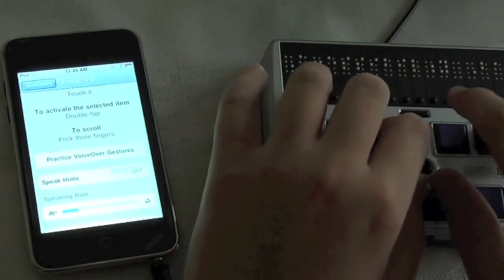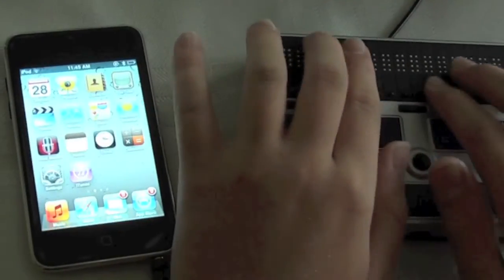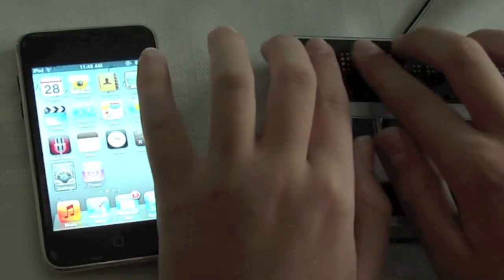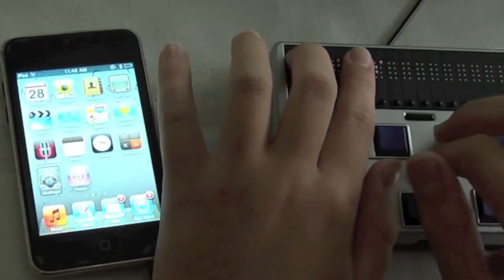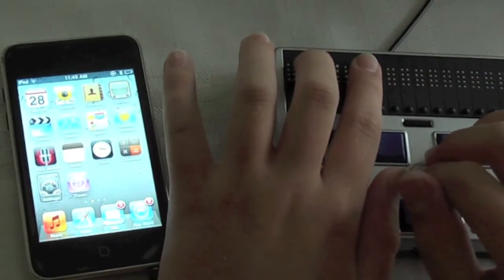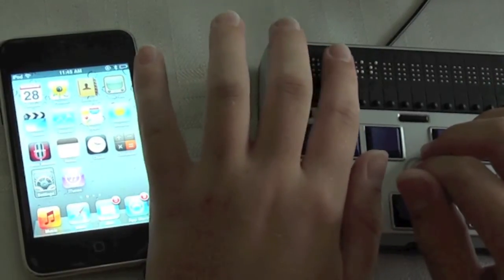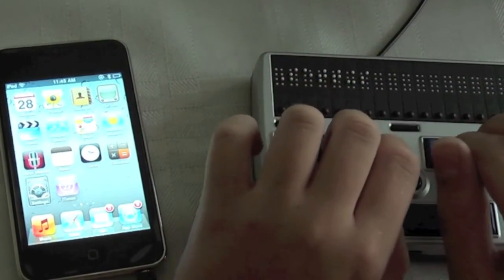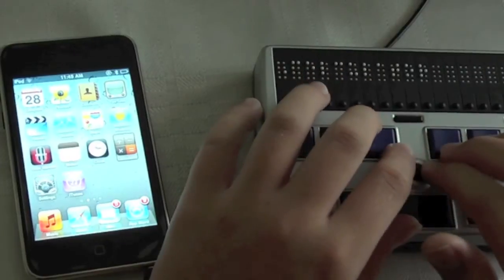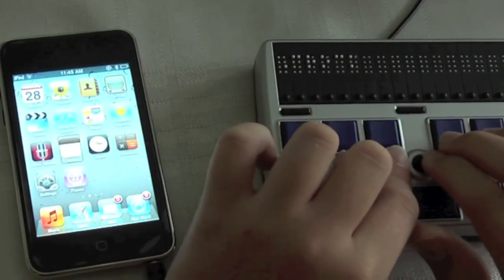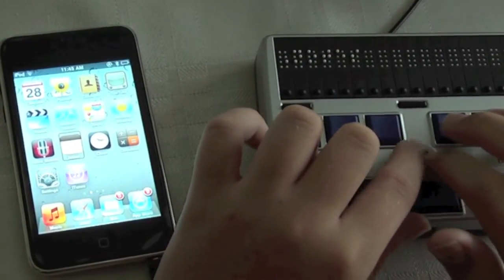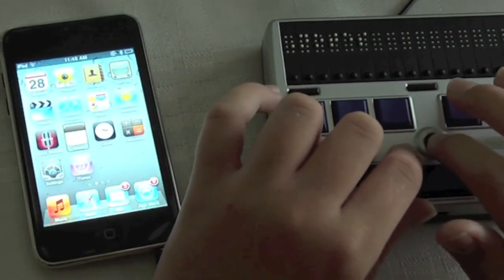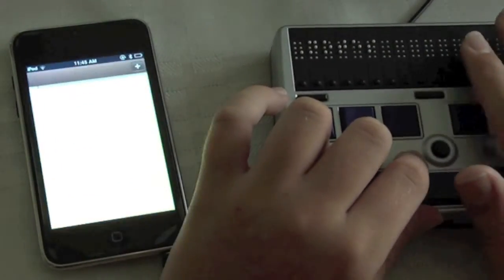And we see home and settings on the Braille display. Now what I want to show you is we can go to an application, for example Notes, that allows you to input text and use the Refresher Braille 18's Braille keyboard to type. I use the joystick left function to navigate to Notes. I'll press down the joystick to open Notes.